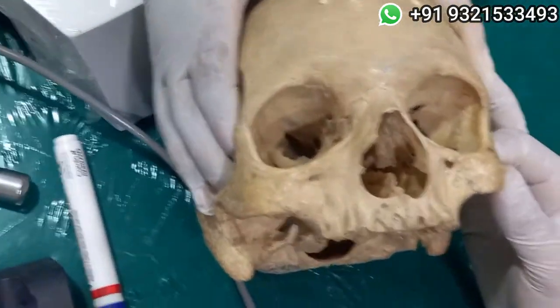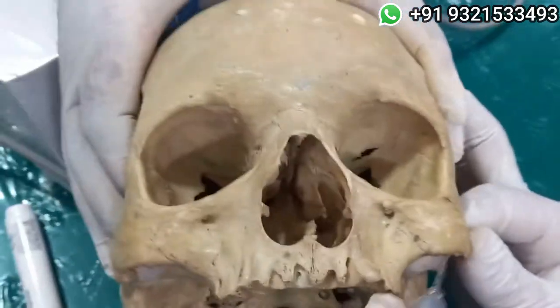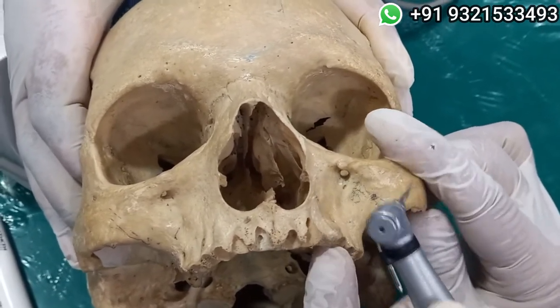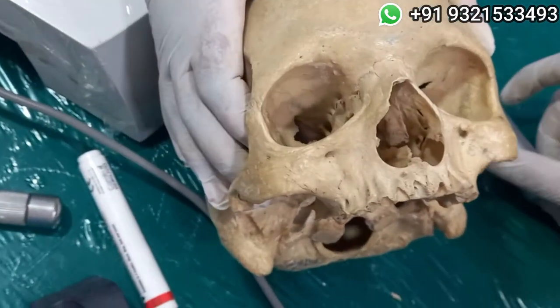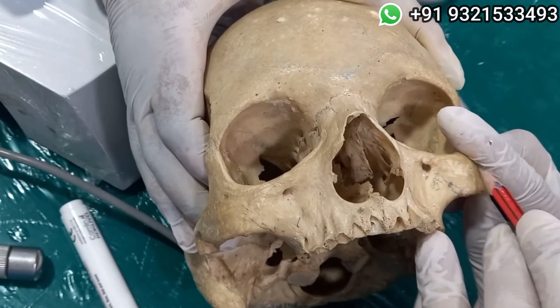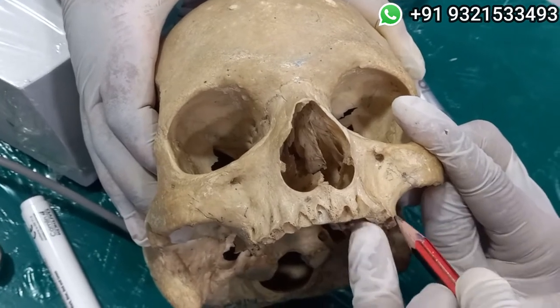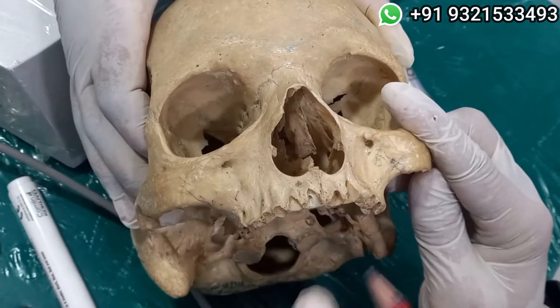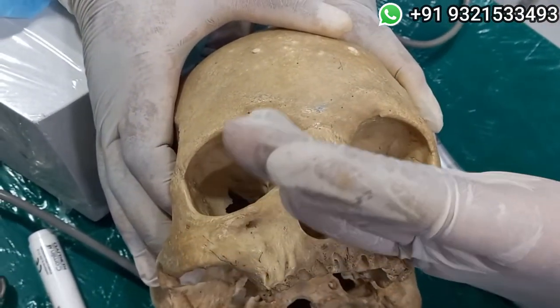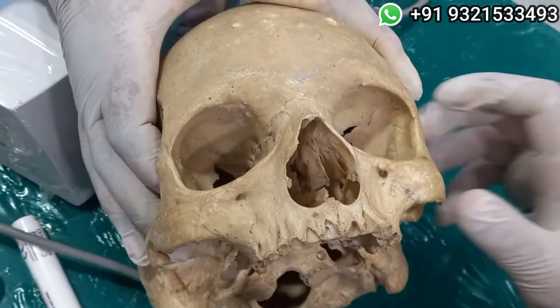So what we will be doing is, first with a 20:1 handpiece, after the reflection, we just mark this point which we wish to enter here. Okay, before I do this, the idea here is you can even take a pencil, and if this is where you want to exit, roughly I draw with the pencil and join these two points and just check like this. Okay, this is where I intend to go. Now you need to understand that the zygomatic bone, like the maxilla, is like this, but the zygomatic bone is lying like this, slightly laterally. So this is the reason we need to create a tunnel.